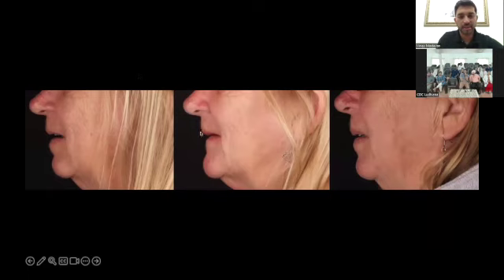So if you see the patient, we were able to provide her with some amount of lip support, although in this case, maybe a fixed restoration would have worked just fine. But just for discussion purposes, I'm saying if the patient does not have adequate lip support, you want to prescribe an overdenture for that patient. So this is the final outcome.